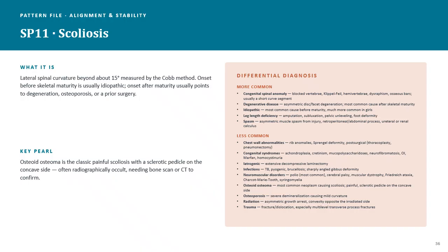Now, with imaging, we might not be able to see or truly appreciate this tumor on a regular x-ray film, so that patient may need some more advanced imaging like CT to actually see and appreciate the lesion. We typically are not going to be able to appreciate it with just a diagnostic x-ray.